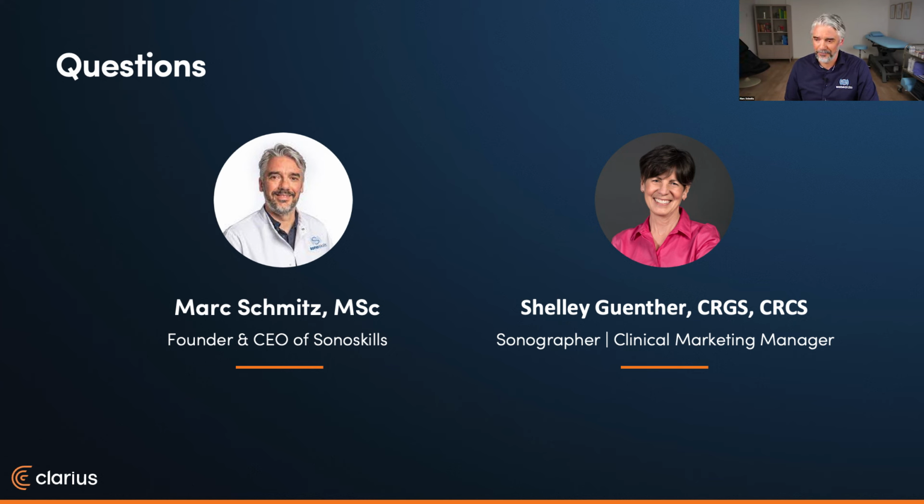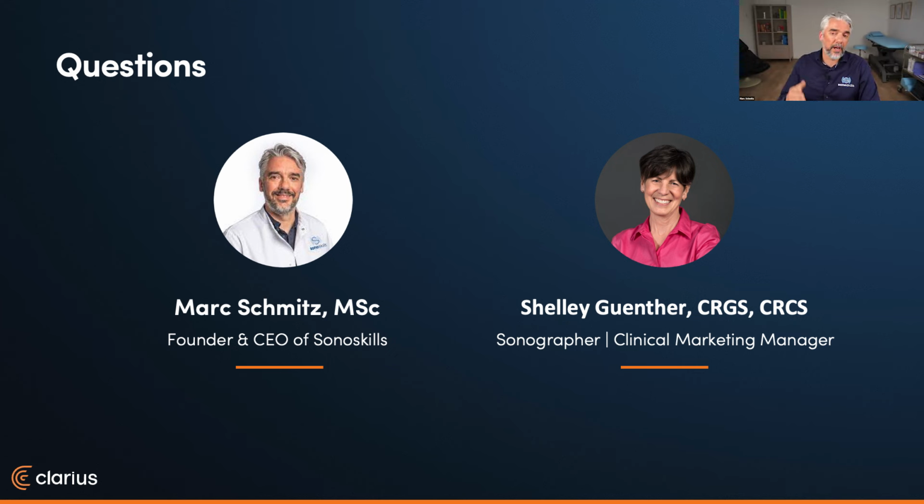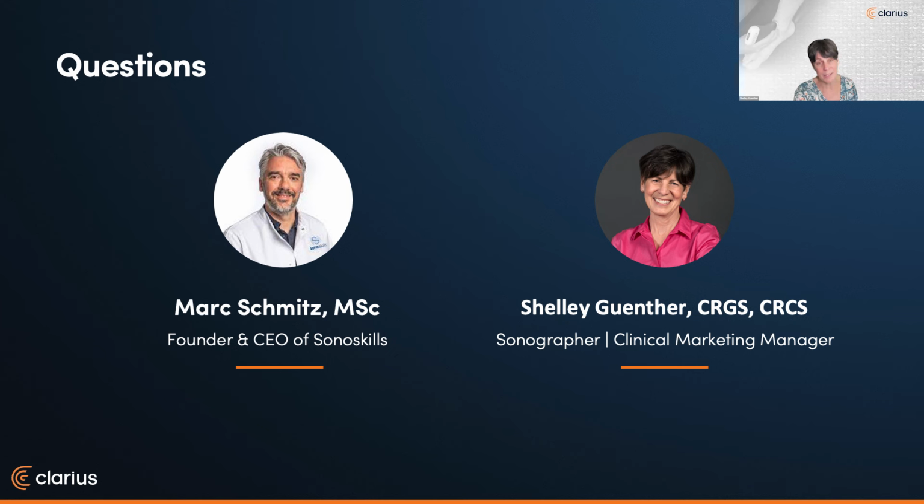It's such a personal preference, though, right? If you happen to like the imaging more on one preset, it doesn't make it wrong. It can be a good starting point, and from there you can go a little bit in that direction or in that direction. Yes, definitely. And one other thing I'll mention is that with the foot and ankle presets, that's where you'll see the MSK AI, not with the MSK preset. So it's kind of specific to the application that you're looking at.